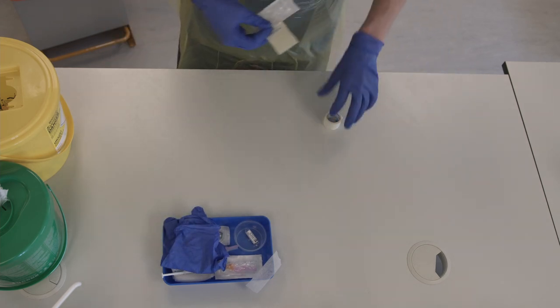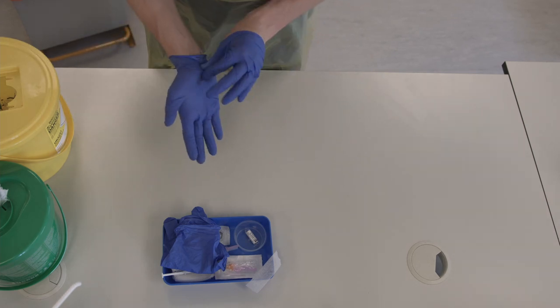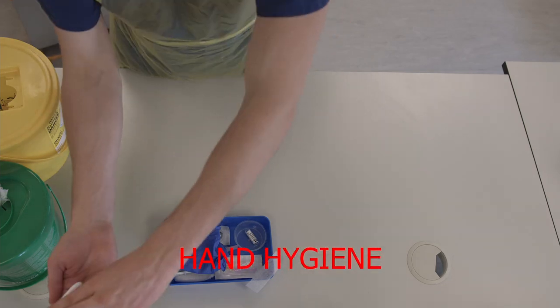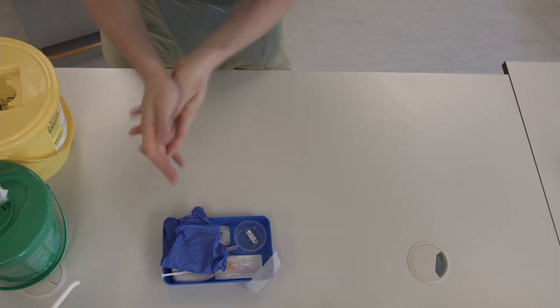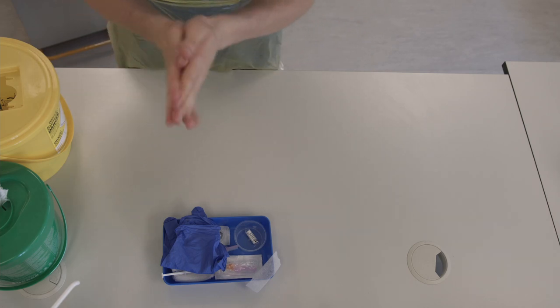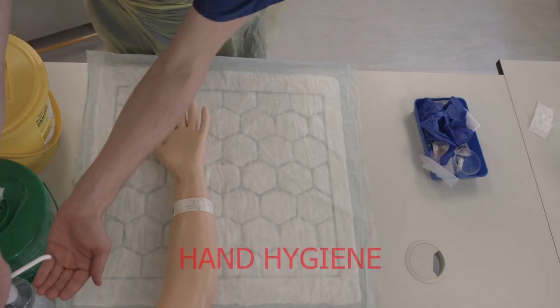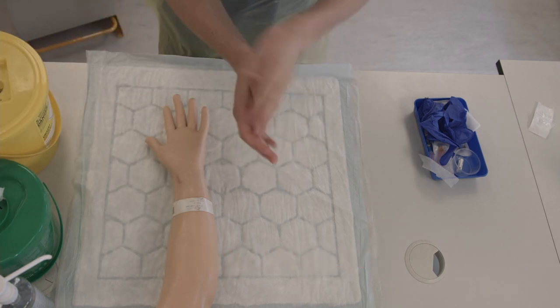Move aside your tray and remove your gloves using the pinch-pull technique. Wash your hands using the 7 steps of hand hygiene. At the patient bedside, you need to wash your hands again before putting on a fresh pair of non-sterile gloves.